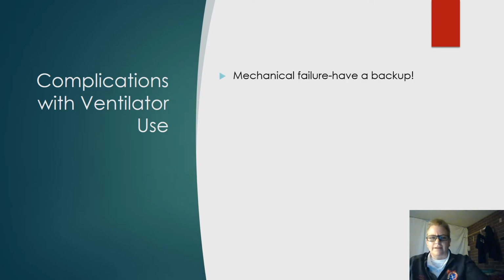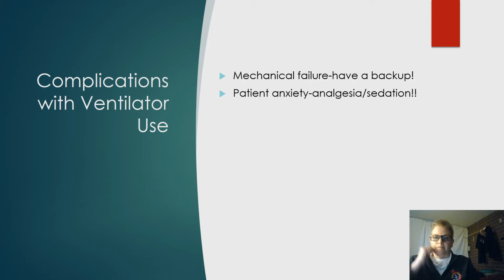All right. Some complications we're going to talk about. Our vents run with oxygen. If we run out of oxygen, it won't be powered. You know, you're not going to be ventilating that patient. So you always have to have a backup. Always have to have a backup. Bag valve mask, have an extra oxygen tank sitting there. All those things will help us.